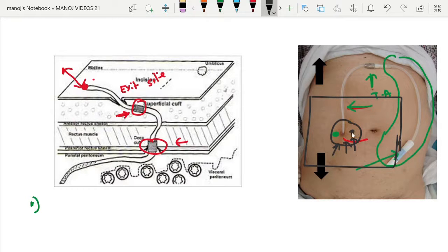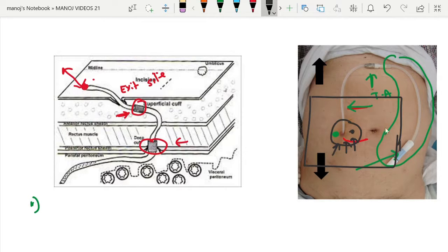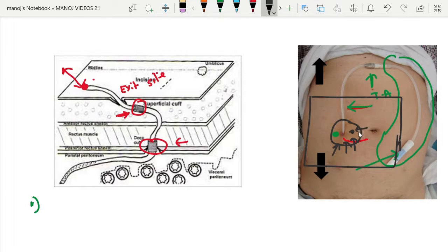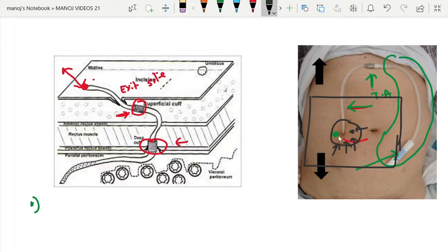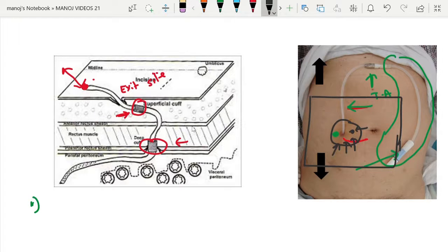The cuff, the first cuff, the superficial cuff, is supposedly somewhere over here. If we palpate it, that can be palpated. So once we palpate the superficial cuff, dissect with the artery forceps till we reach the cuff.